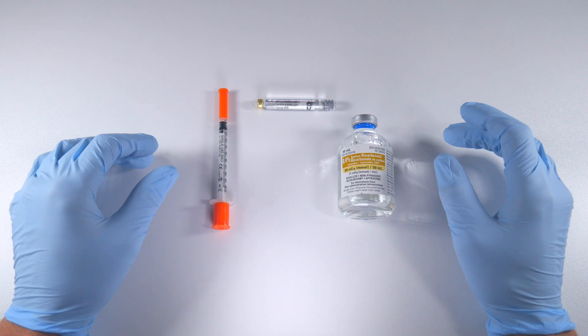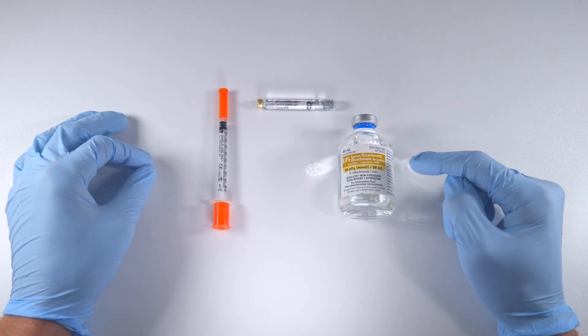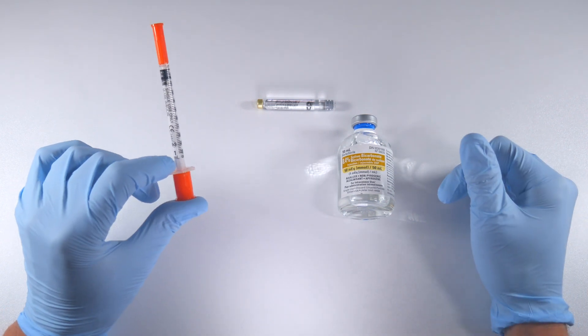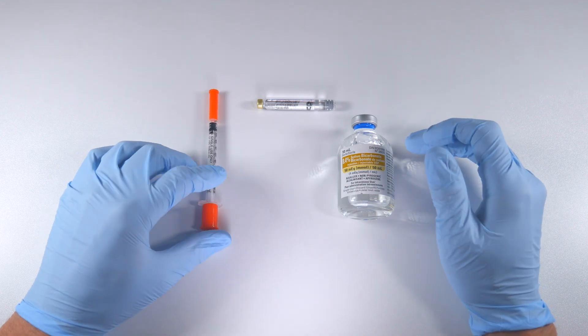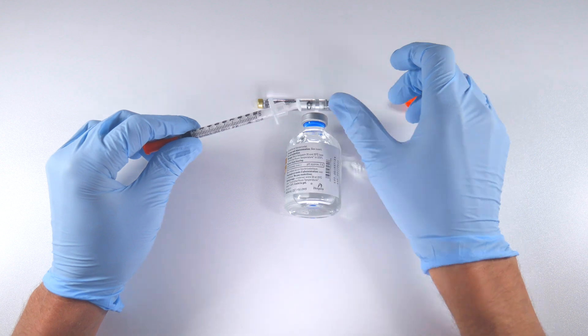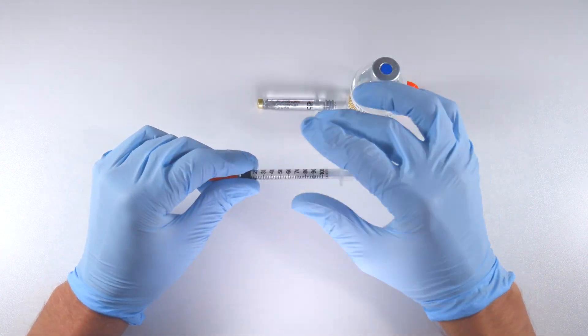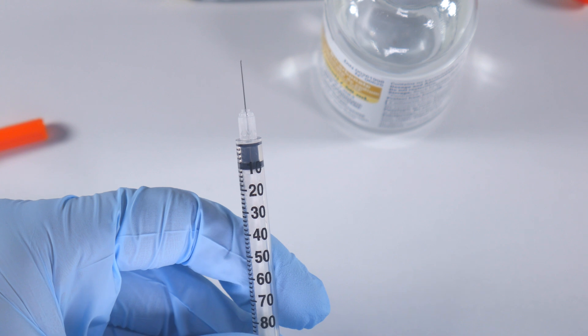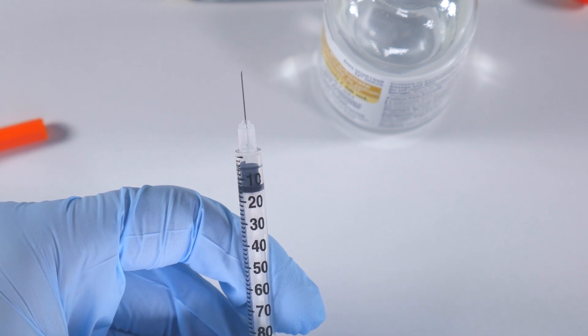Again, we've got our one mil syringe, we've got our sodium bicarbonate. What you do is essentially you pull off these caps—it's going to roll away—and you expose the needle.